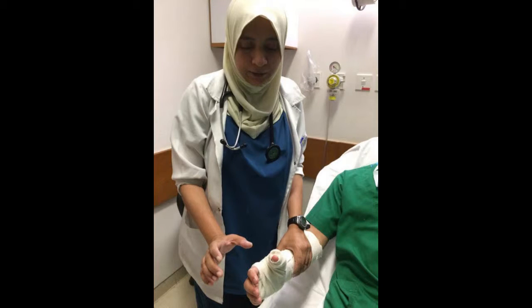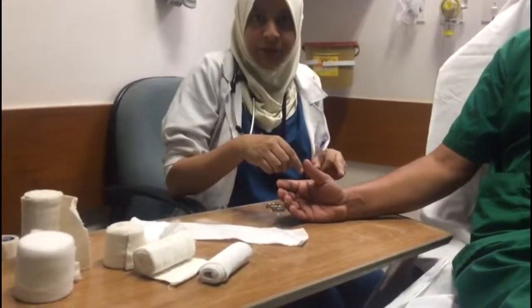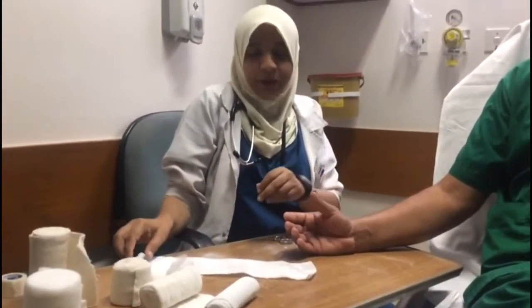First you need to assess distal pulse, motor and sensation. Apply padding and splint material to the distal aspect of the forearm, covering the thumb. The wrist should be in slight extension, approximately 20 degrees, with the thumb in functional position.